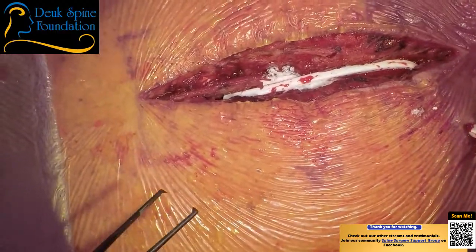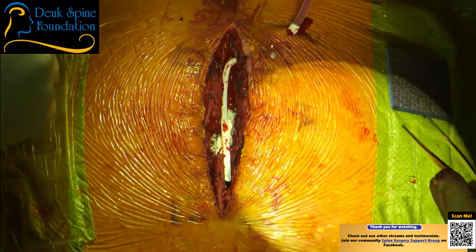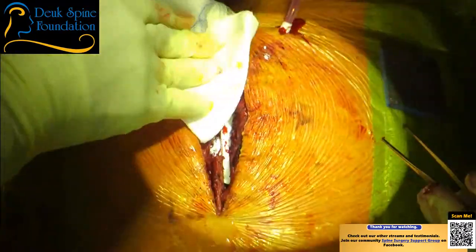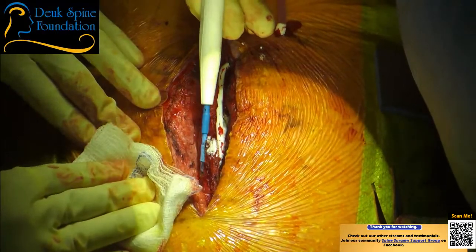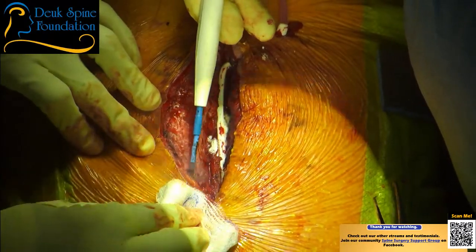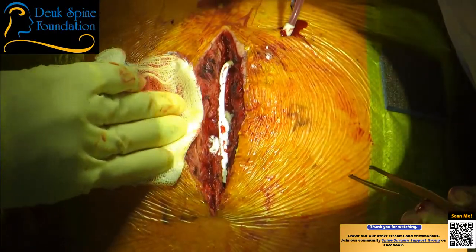So I need to figure out where these little bleeders are coming from. That's what I don't understand. If his pressure is normal, why are we getting some bleeding? Get me a Raytec and a Bovie. Otherwise, we're never going to get closed. There, that's what I need you to do. I don't understand why we're getting pop-off right now at 92. That makes no sense.